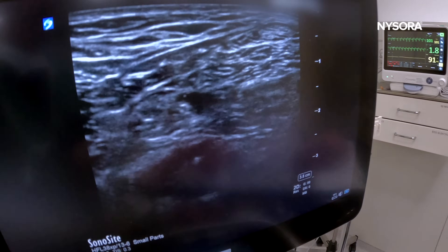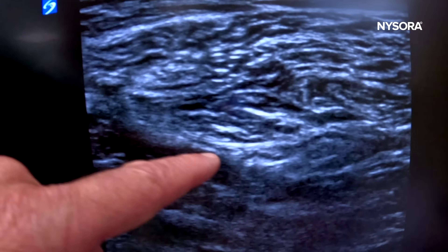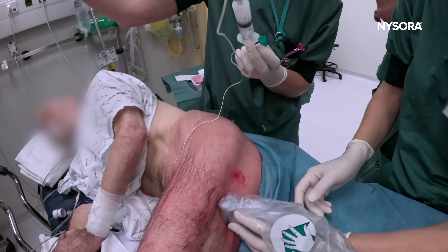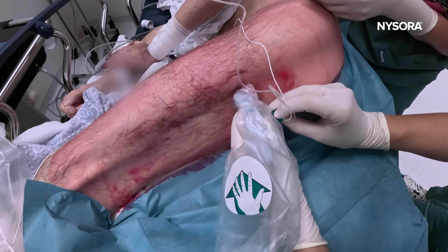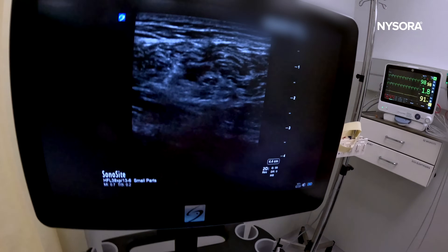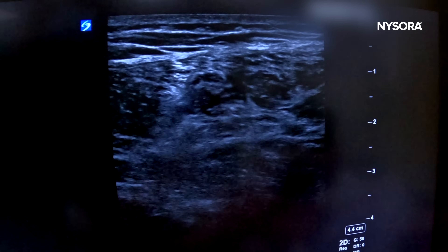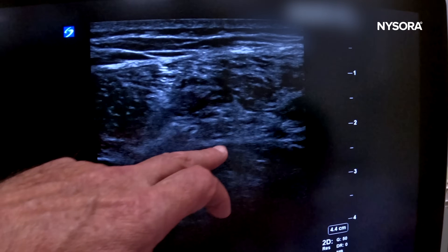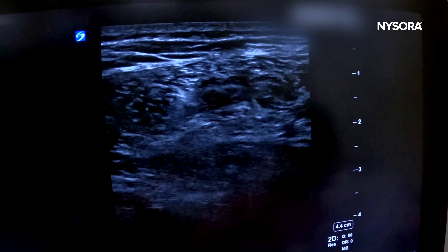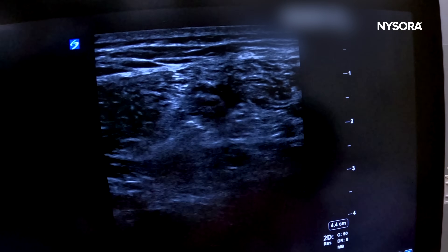Follow it up. You will get a much nicer image once you inject local anesthetic. That's the tibial and common peroneal nerve. Redirect a bit more laterally. Pop in. You don't really need more than 10 mLs of local anesthetic. The injection is going super well.